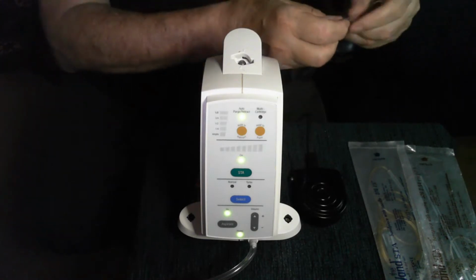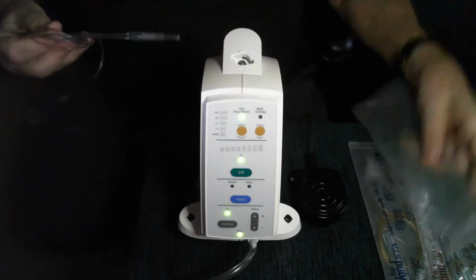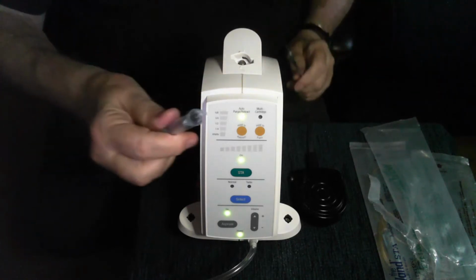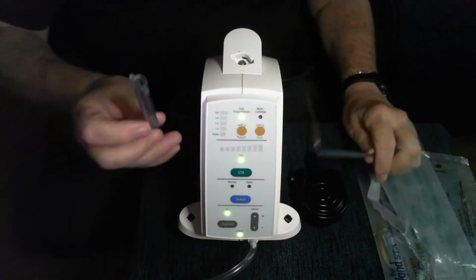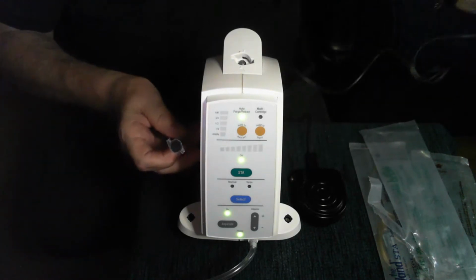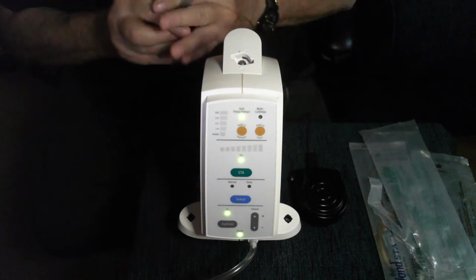So to open this, it says tear to open. We pull it out of the bag. And we have 3 parts to the handpiece. The first part is the cartridge holder. And this cartridge holder has a little spike that's going to pierce through the membrane on the cartridge, as I'm going to show you. Then there's a microtubing so that the instrument could be maybe 4 feet away from the patient, okay? Then we have the wand handpiece.